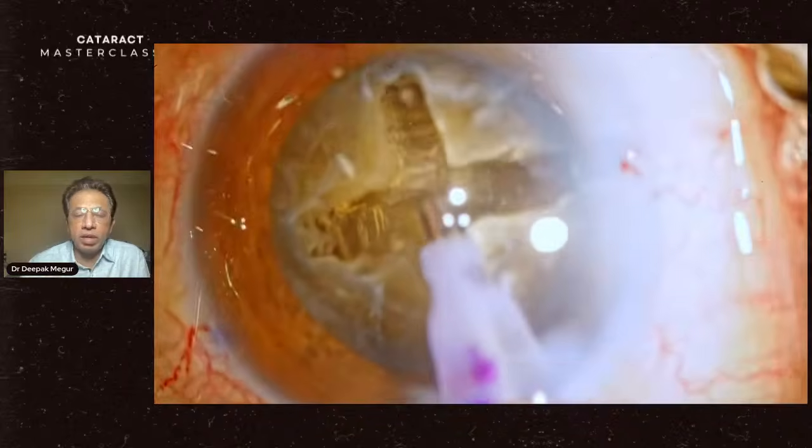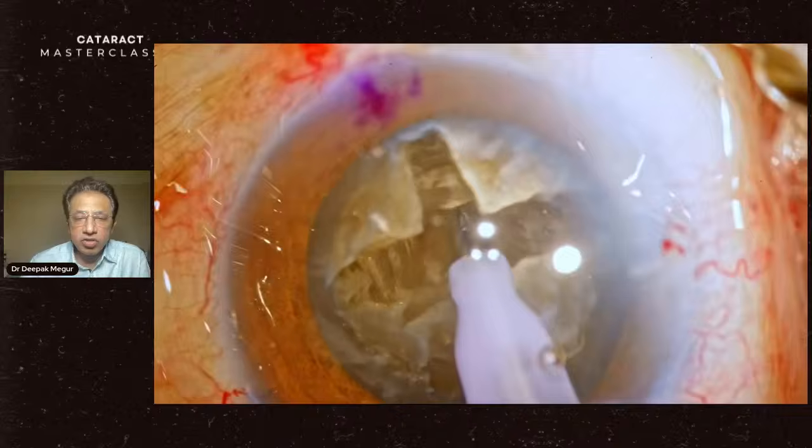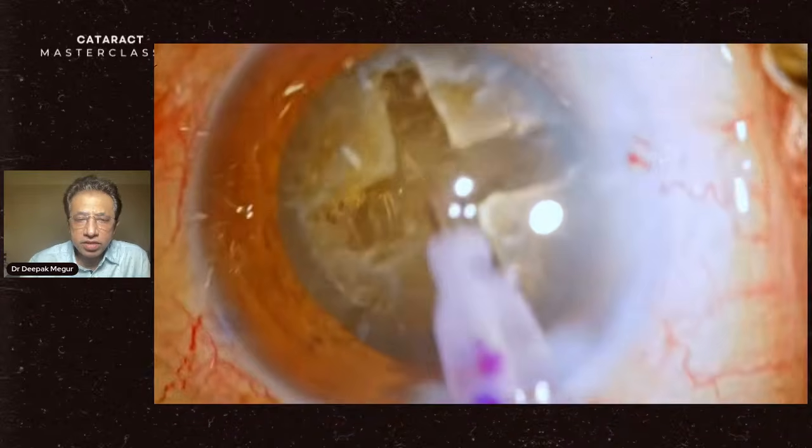And these are very bulky. The lens thickness would be anywhere 4.5 millimeter or 5 millimeter with the thickness of these lenses. So that is the trick. So I'm just continuing to trench.